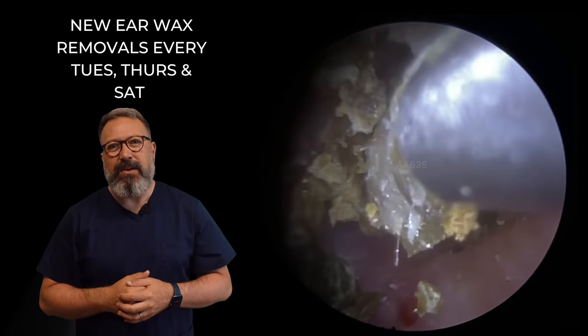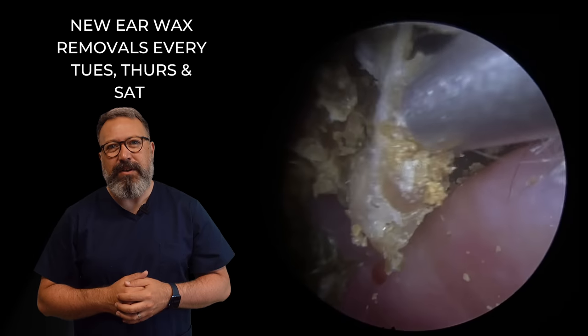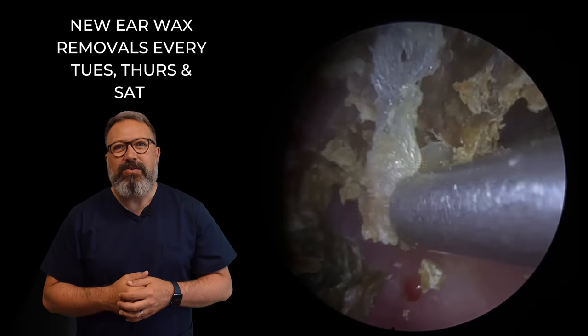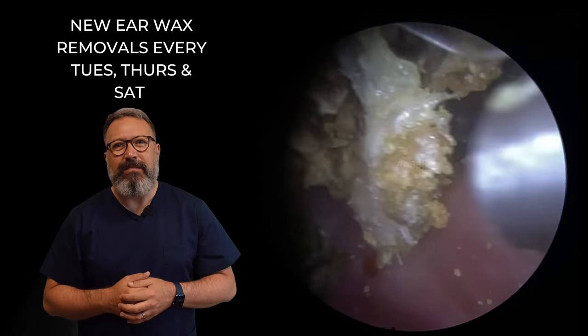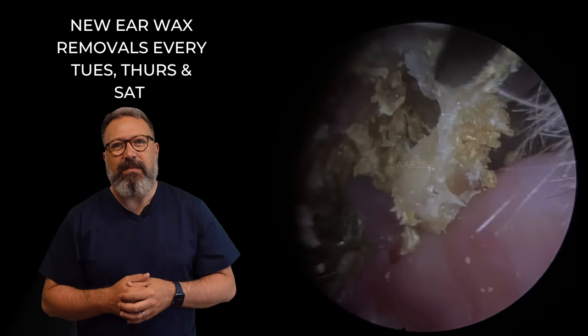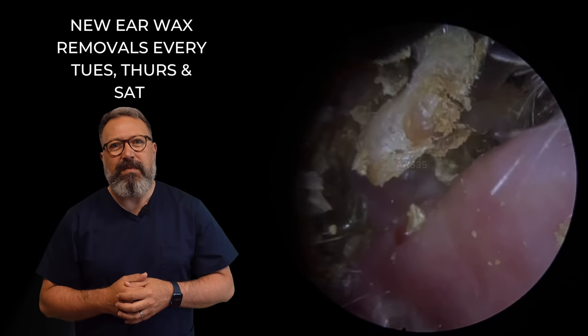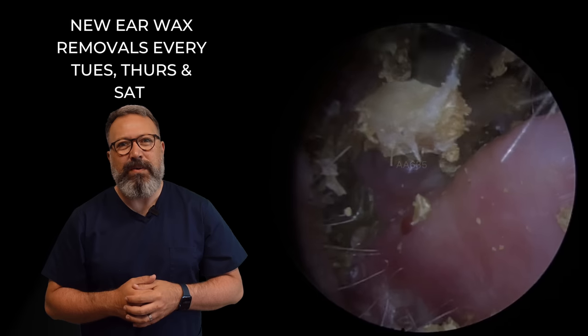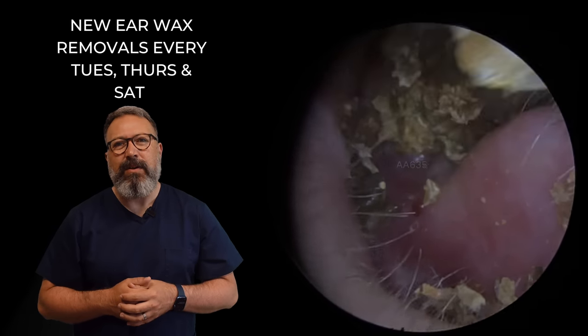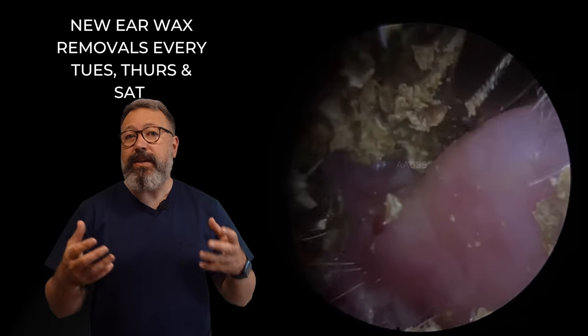Pulling that section down. As you can see, the dry skin is attached right up in the attic there. Let's try and pull this down — it's not quite coming away. We're going to have to put forceps on this one as well. It's got a good grip on that skin — let's give that a pull. I think we're just going to get that little bit of skin there, but it gets it out of the way so we can get to the next section. Let's grab that piece — that's come away nicely.